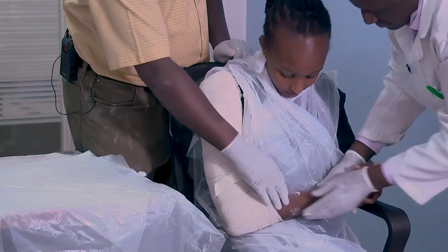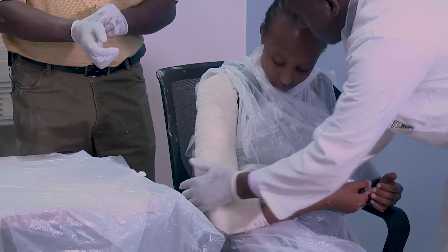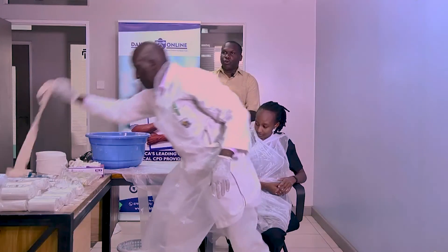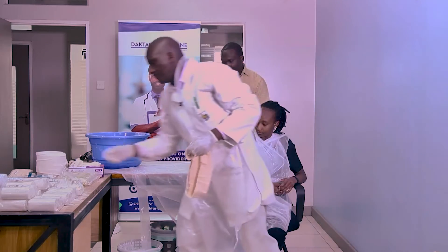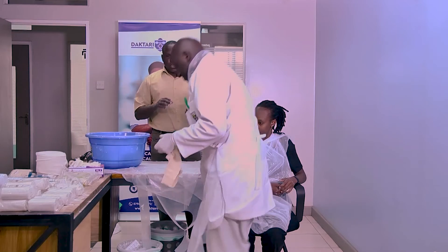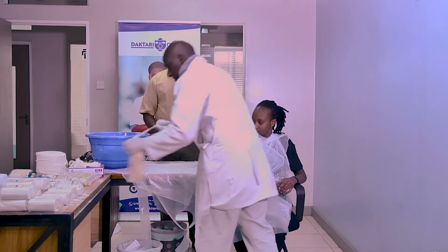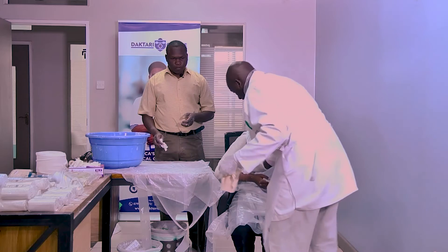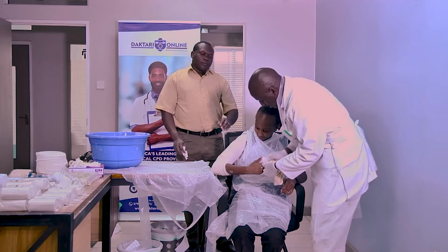Don't forget to always clean the patient and explain to them if there are any issues. We cannot overemphasize the fact that when putting on the slab, the crepe bandage is really just to hold it in position — it should never be tight. From there, wipe your patient clean, and don't forget to give an arm sling.